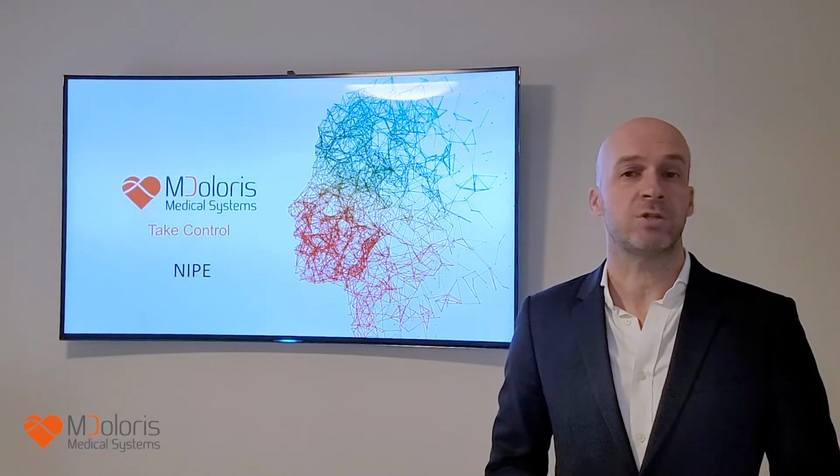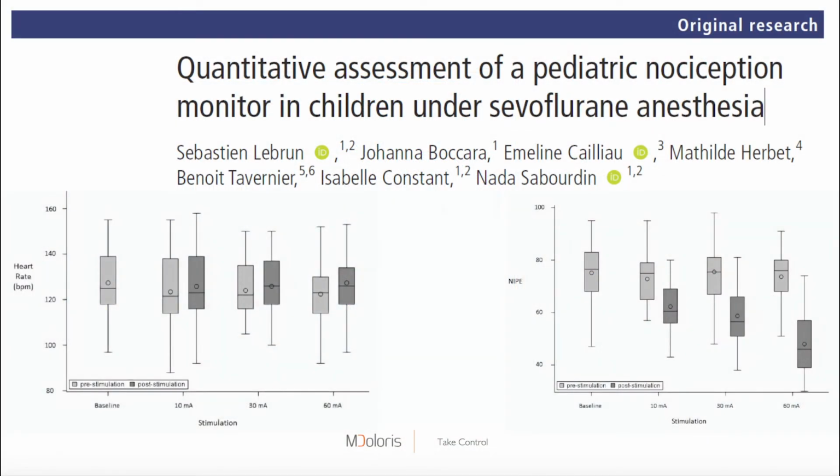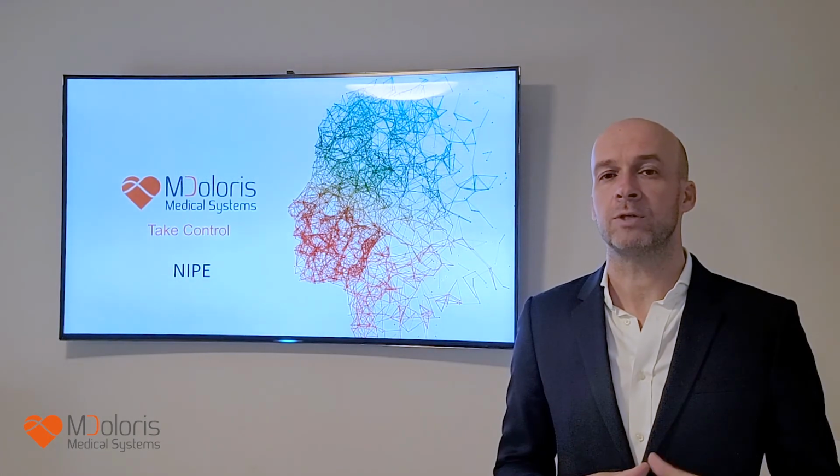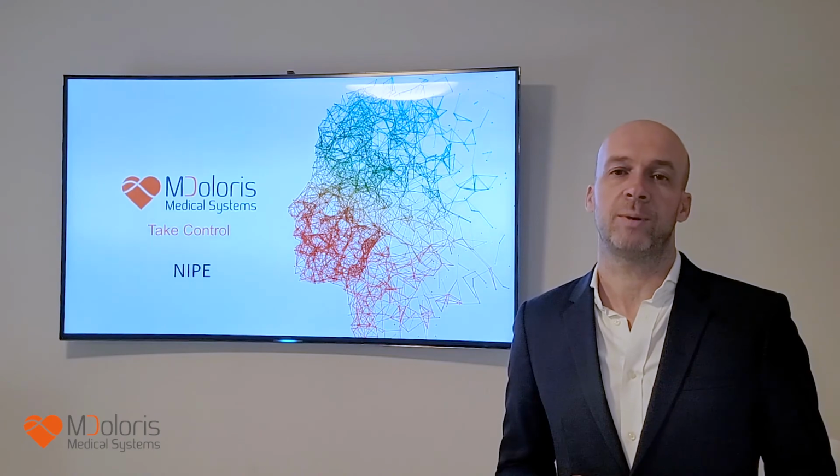Some studies have shown that the NIPE value is much more precise and specific than heart rate and blood pressure to detect nociception. In this way, you will be able to titrate your analgesics in a better way, so you will give much better care to your patients.